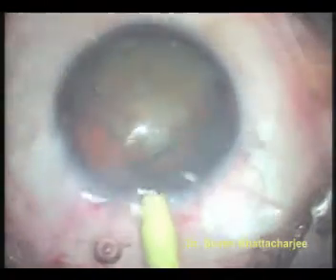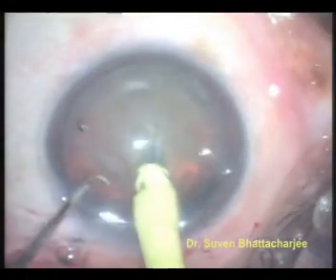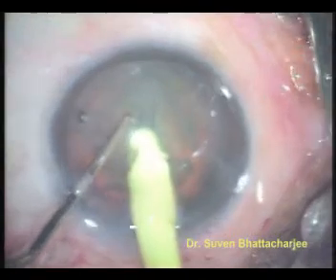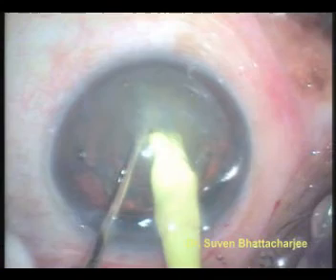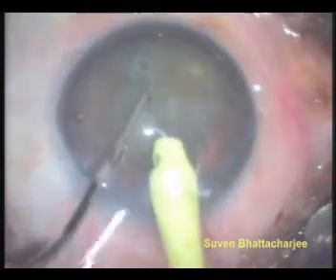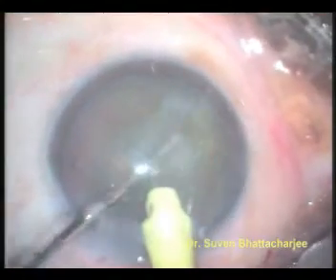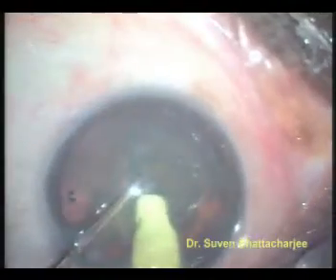The phaco needle along with its infusion sleeve is inserted into the anterior chamber. The nucleus, or the seed of the cataract, is impaled with the phaco needle using ultrasonic energy and vacuum. A sharp instrument in the other hand called the chopper is used to crack the seed into two, and then this nucleus is rotated by 180 degrees to complete the crack.